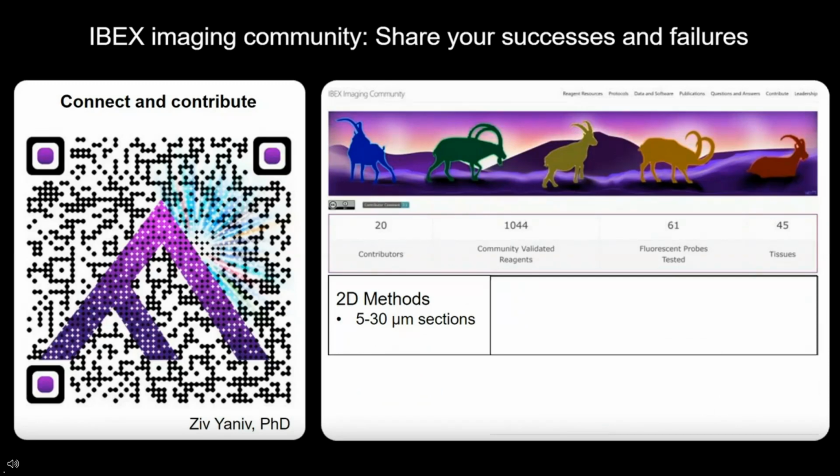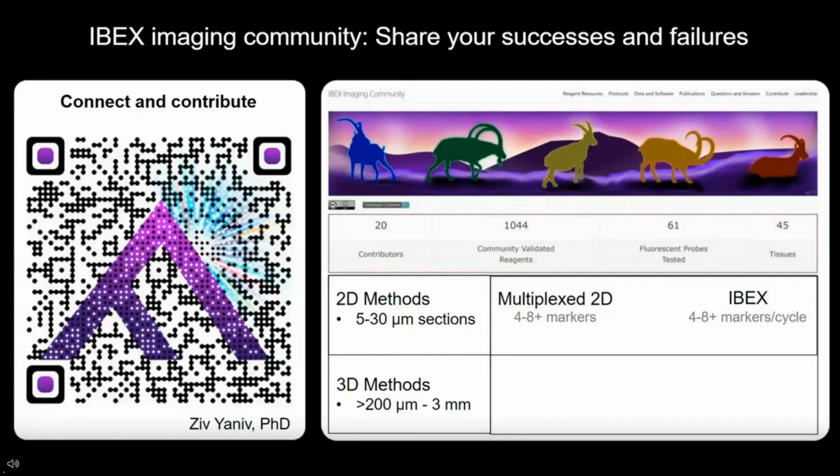And what is covered in here? Well, we're supporting many different methods. These are 2D methods that we define as tissue sections that are maybe 5 to 30 micron sections. They could be fixed frozen or FFPE or many, many different tissue preservation methods. We do multiplex 2D. Those are your standard non-iterative, maybe 4 to 8 markers. We also support Ibex, of course, as the name implies, but I really want to use this slide to say it's not just Ibex. We also have 3D methods.